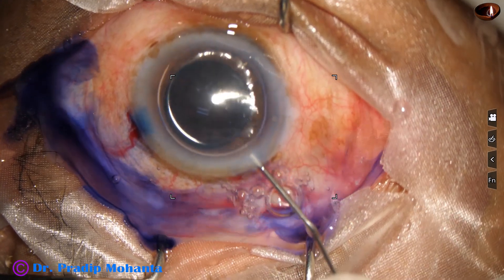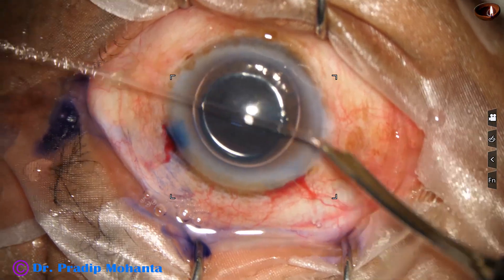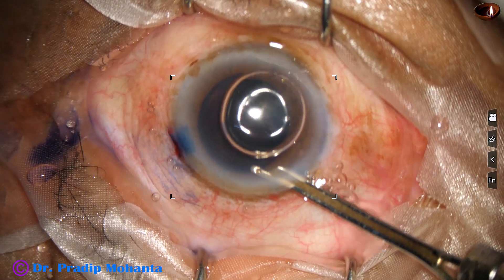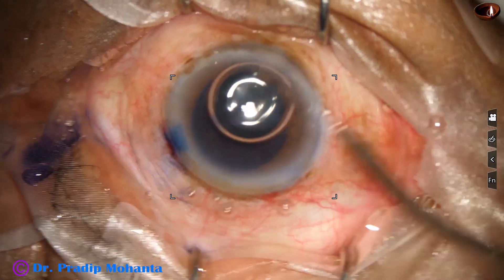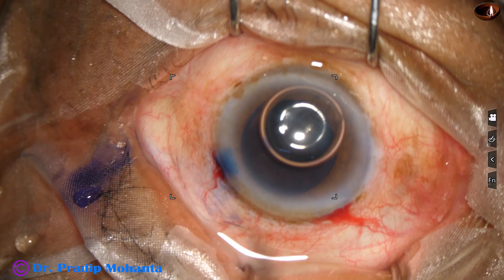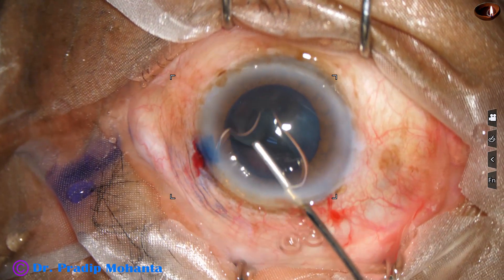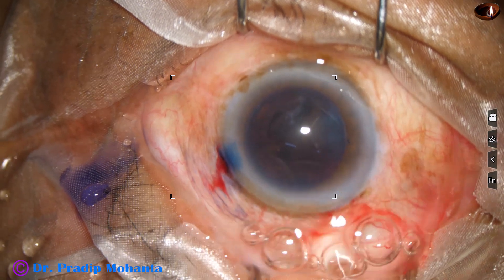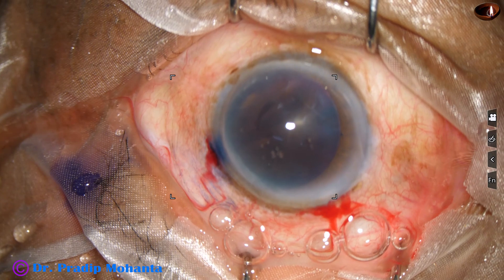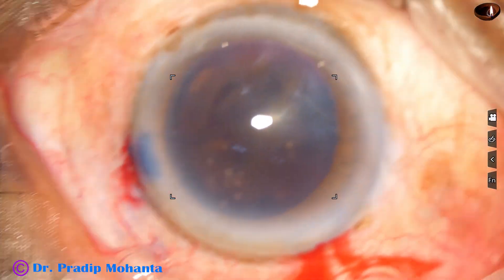This is adrenalin — the pupil had not dilated well, only up to 5 to 6 mm. After injection of adrenalin, it has dilated to maybe 7 mm. This is adequate, but for hard cataracts, if you have a nicely dilated pupil it is much better.